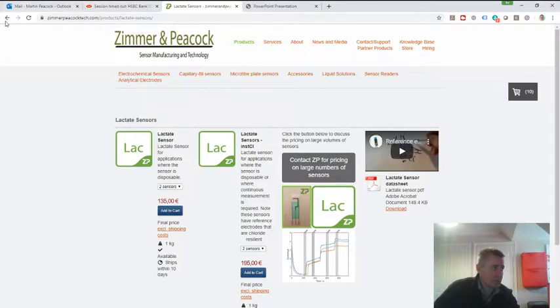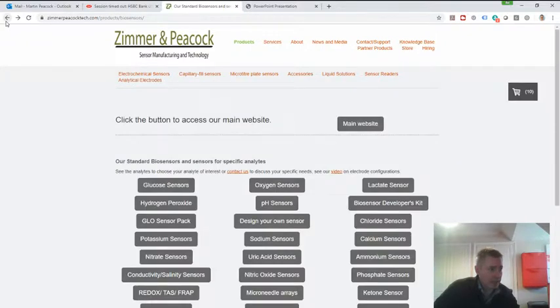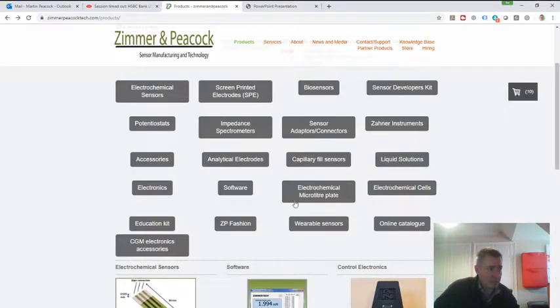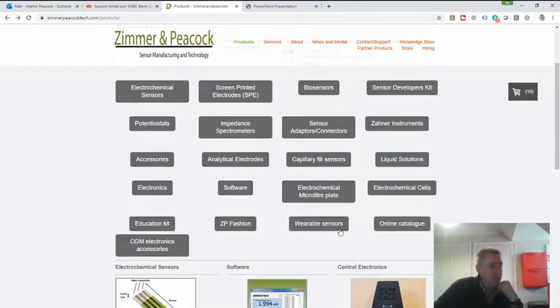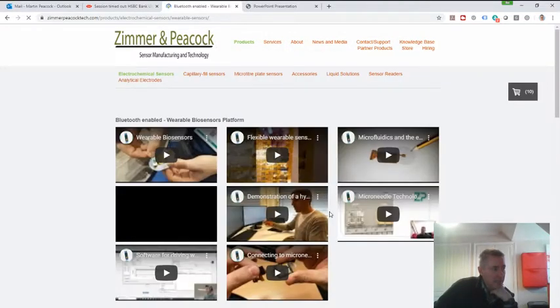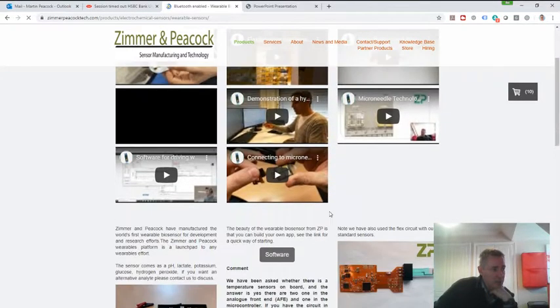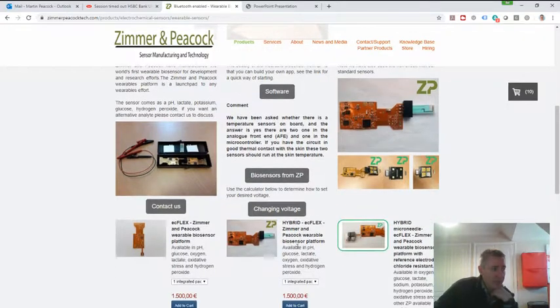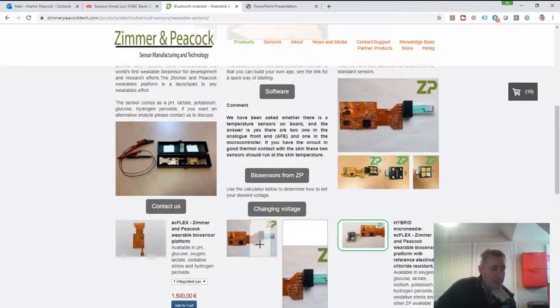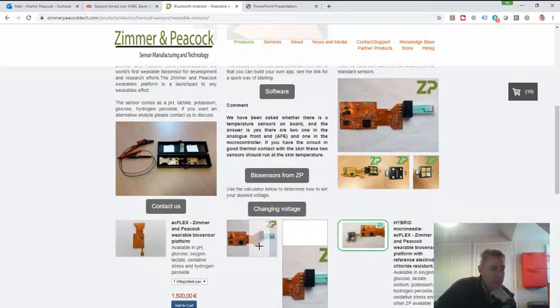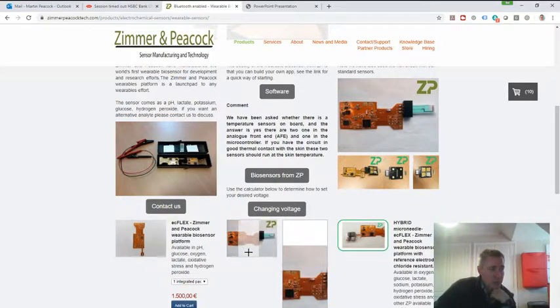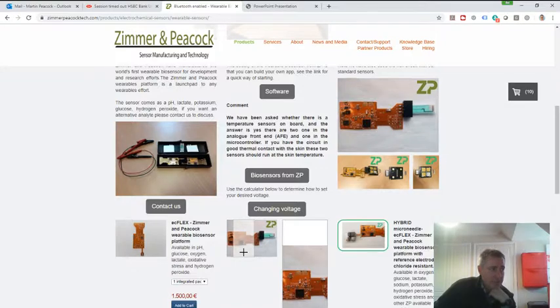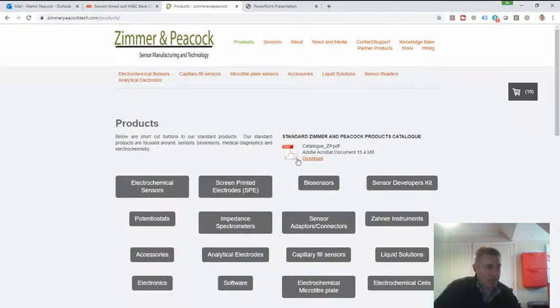So in summary, if somebody's starting out with the idea of measuring analytes in the sweat, and they want to have a quick, a much quicker kind of route to development or to product, then I would say the easy flex is good. I probably get it in this format where you get the electronics and there's a connector on here, which allows you to connect in the sensors. And then you can choose the appropriate sensor from our bias sensors page.